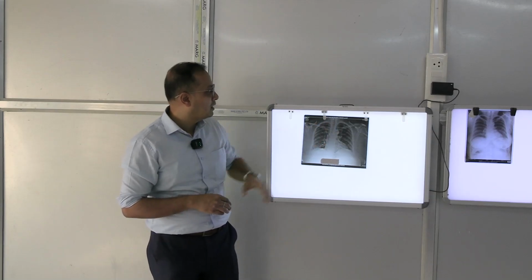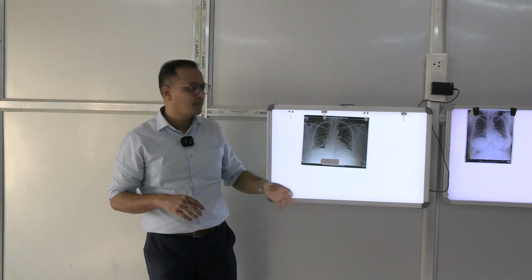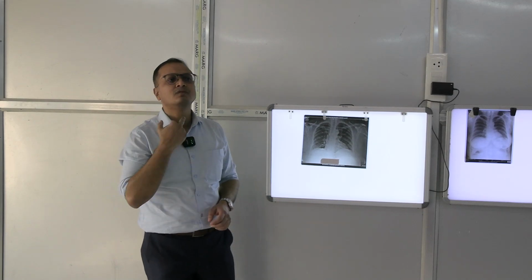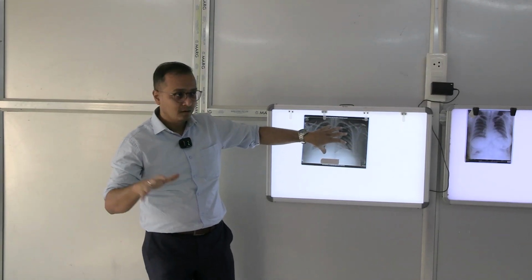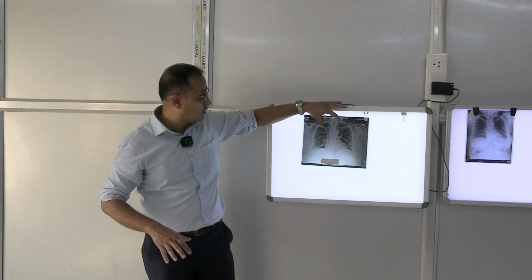There is a physiological reason why this trachea is not present exactly in the midline. In physiology you are going to identify the positions of the trachea based on the tracheal cartilages and identify its positions. So you will do that exercise in physiology. I am leaving that part for the physiology classes.